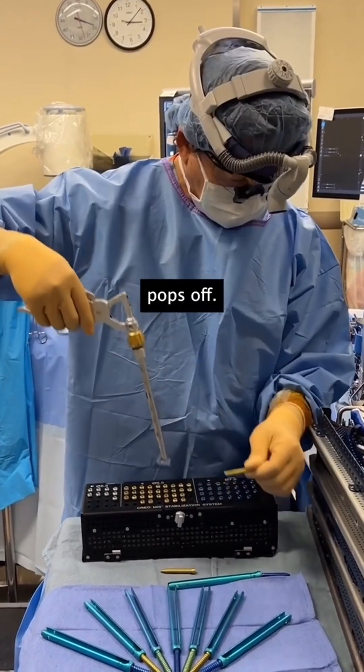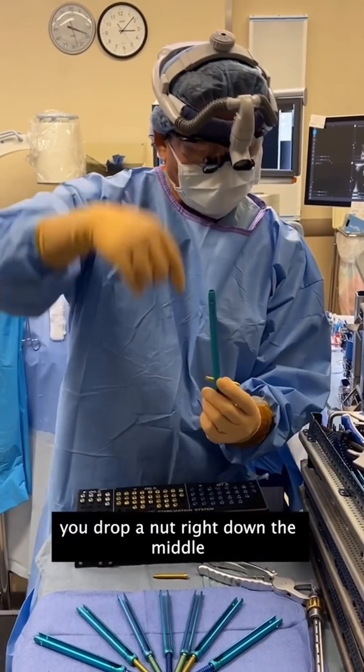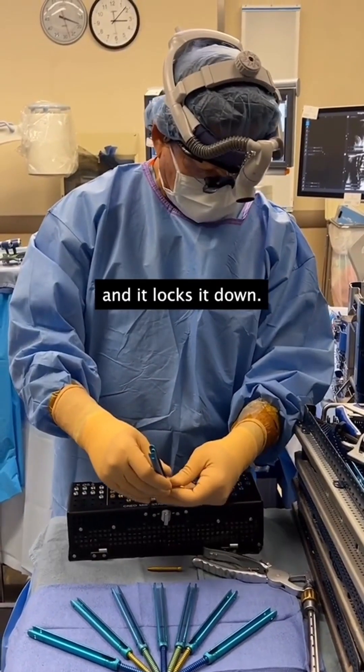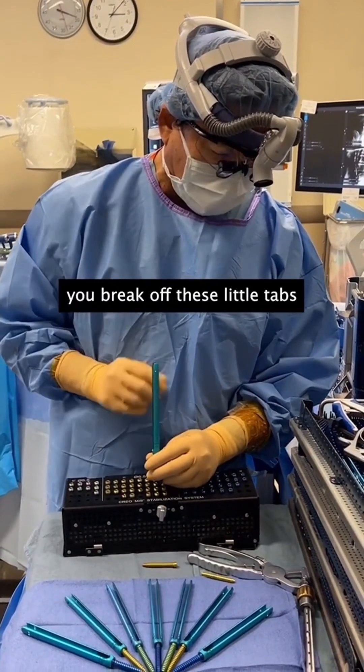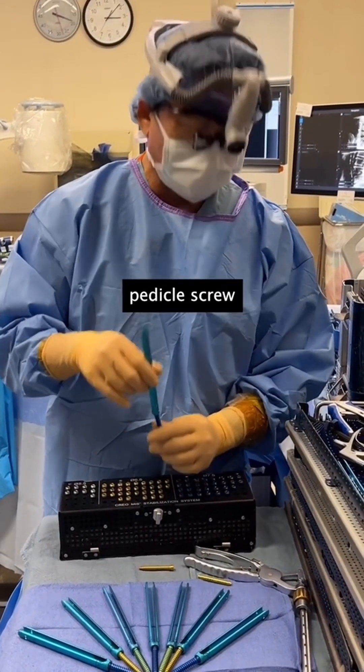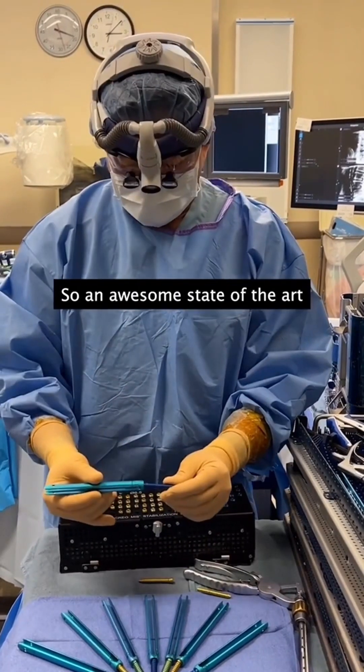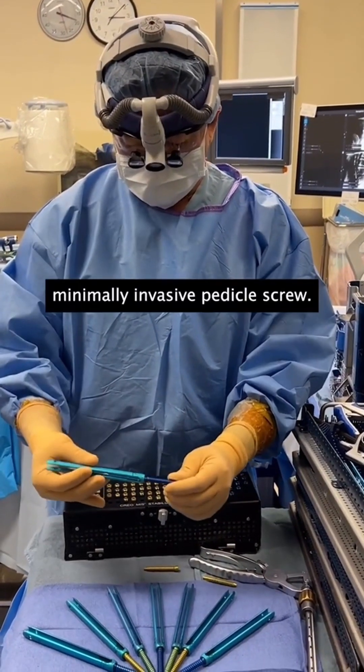It pops off. The rod is inside this rod sleeve. You drop a nut right down the middle and it locks it down. You break off these little tabs, and that's how you have a percutaneous pedicle screw all lined up, passing a rod without opening the incision — an awesome, state-of-the-art, minimally invasive pedicle screw.